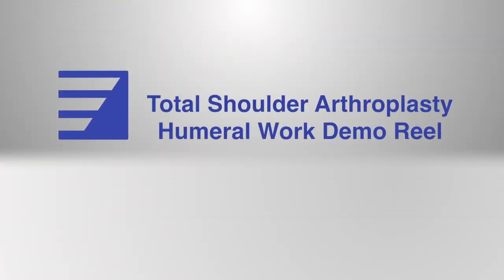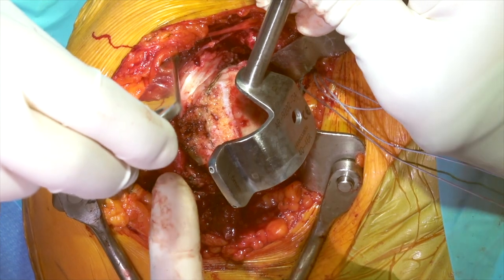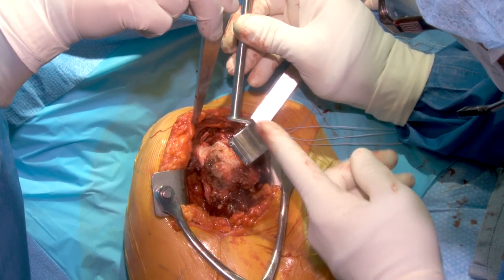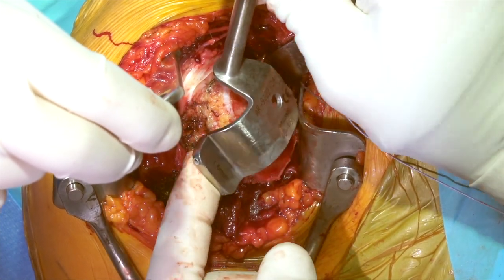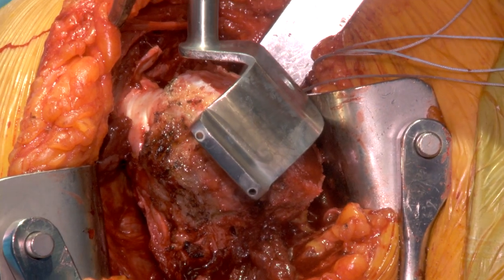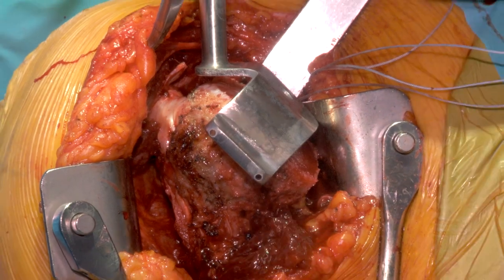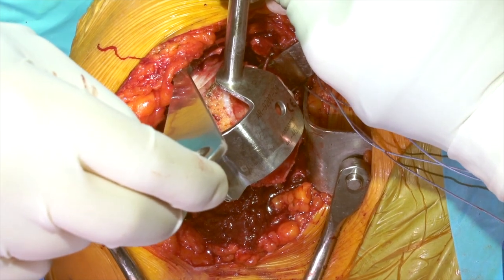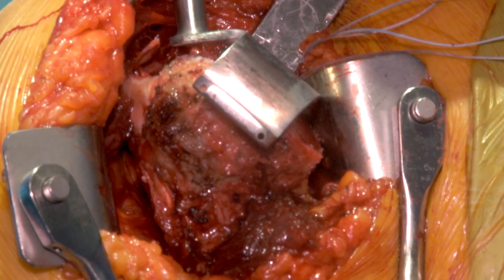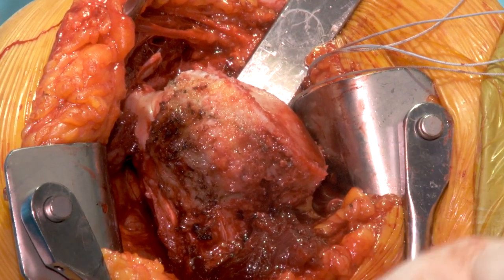We have a couple of different guides here. This guide is set at 132.5 millimeters of inclination because the range of inclination is from 125 to 140, and this sits right in the middle. We can find the bicipital groove, go just behind it with the guide pin, lean off our retractor, and this can go down the humerus and identify our intramedullary canal. If you're not sure, you can look at your cut that you're about ready to perform — the marking from our bovie is pretty accurate to where we wanted to be.